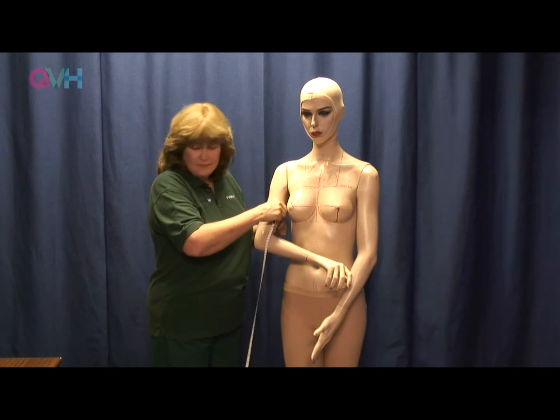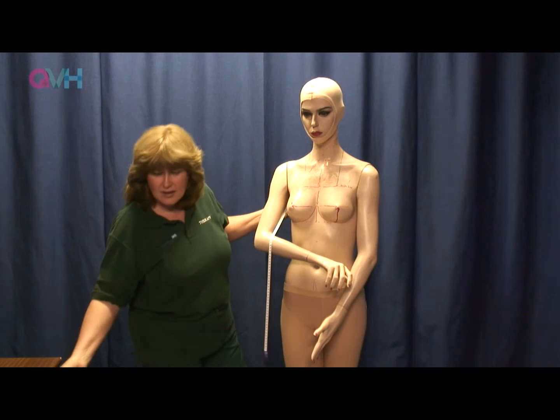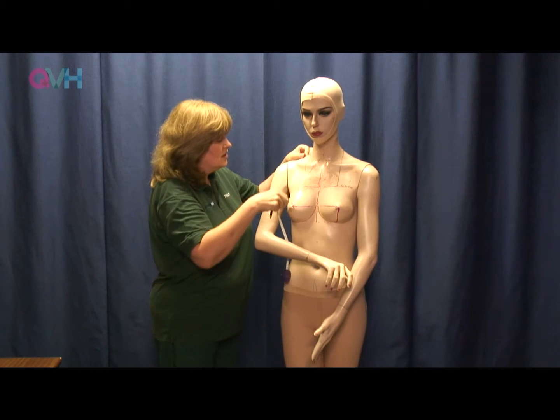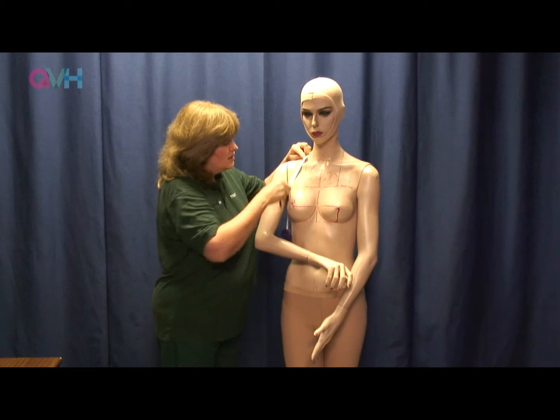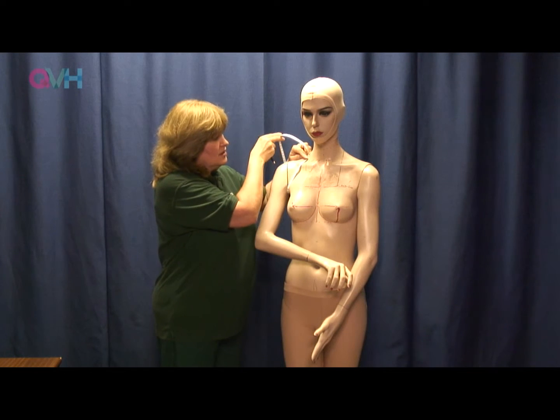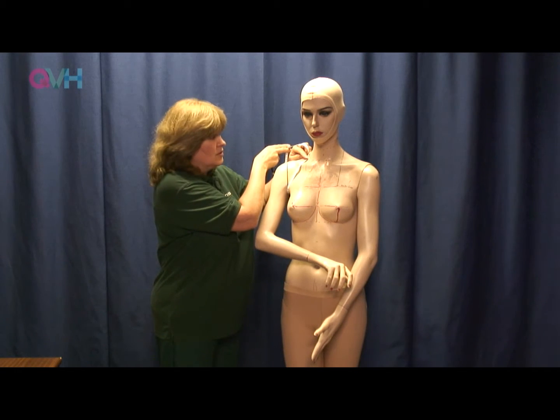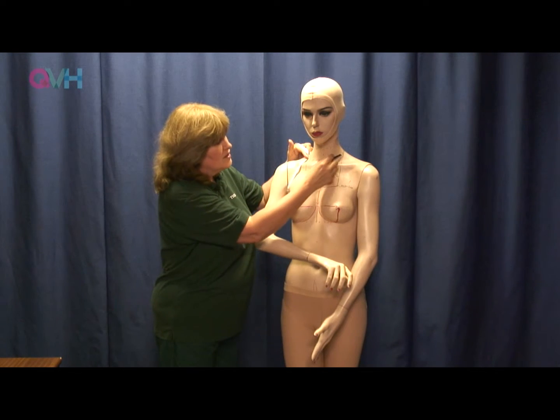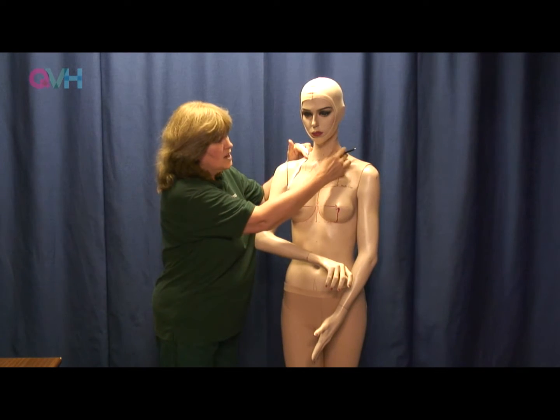And with the arms, as is shown on the measuring form, you would take a diagonal, which would be the line of the raglan of the sleeve, and you'd take the tape measure diagonally, being aware that pulling a tape measure in someone's armpit can be uncomfortable.